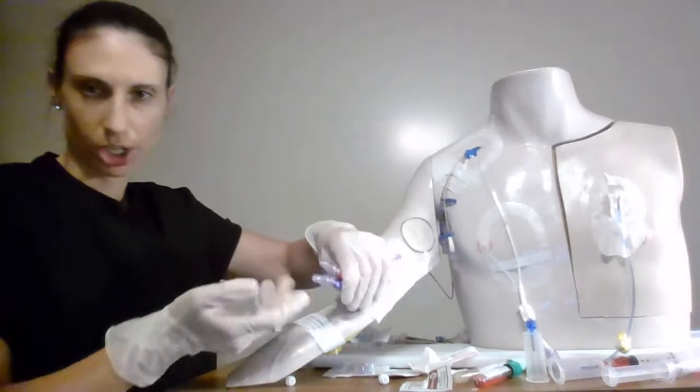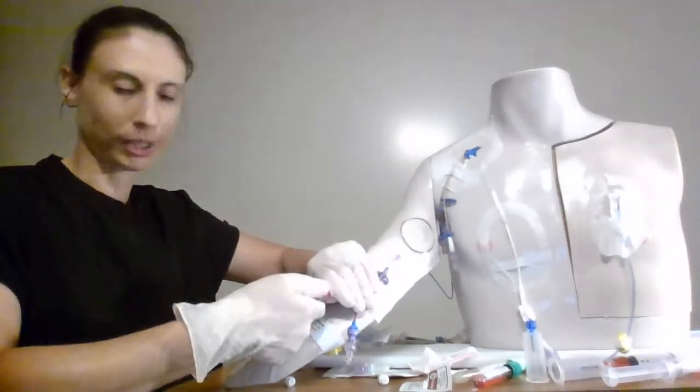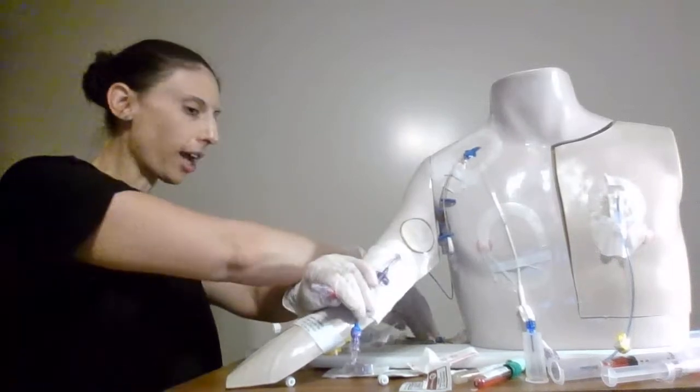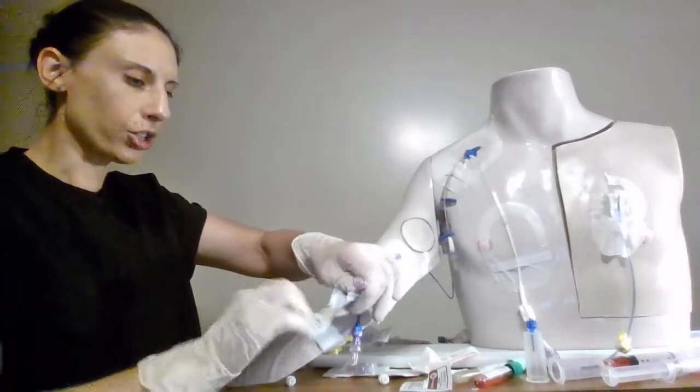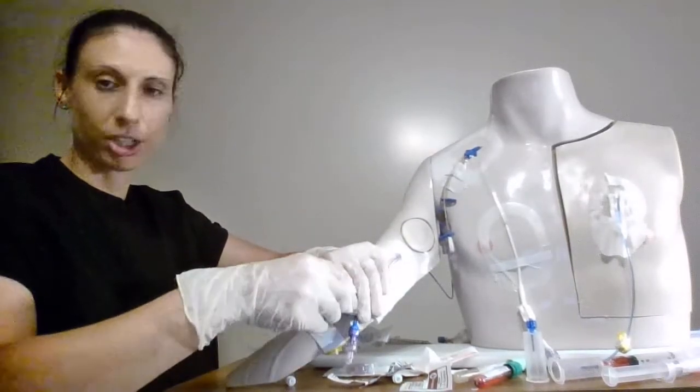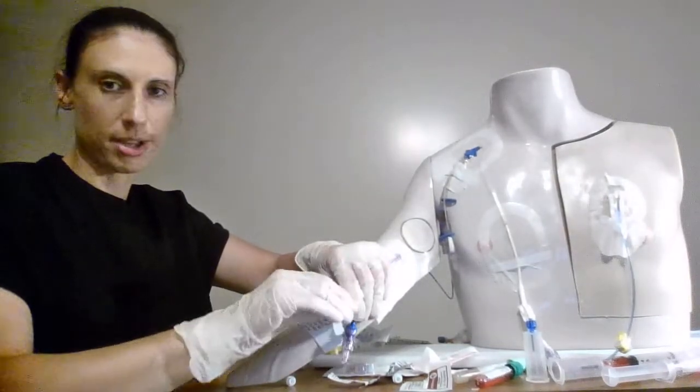So normally we change all caps at the same time. So we would change both but in the lab we can just change one for practice. So we're going to clean this cap with an alcohol swab. But we're going to clean the connection. Just because there might be blood or medications crusted where the cap meets the lumen. So we're going to swab there.